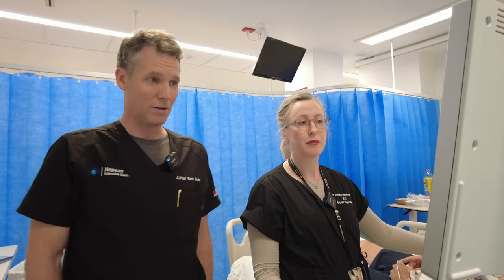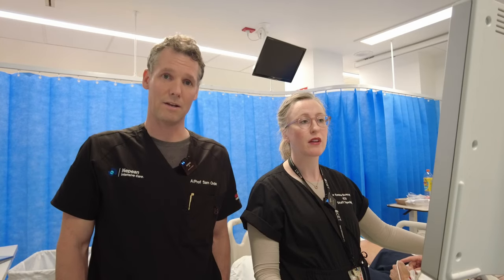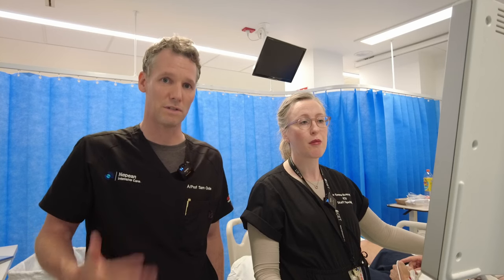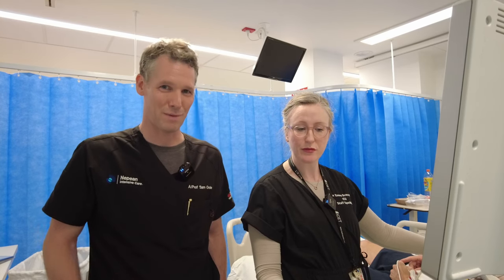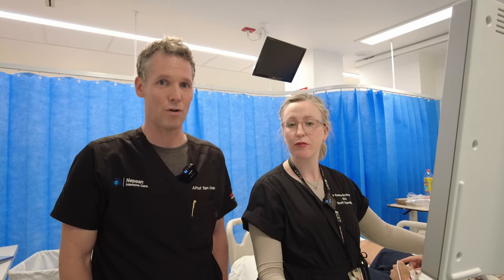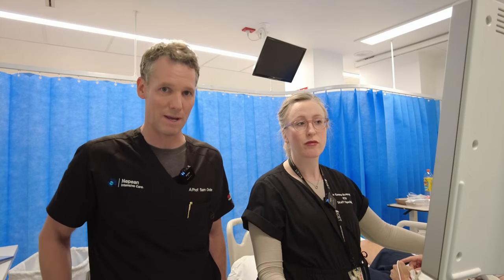Thank you for joining us. We are going to scan a really nice 40-year-old gentleman who's coming to the ICU after a syncopal episode, but he's got a past medical history of transposition of the great arteries that happened when he was a baby.